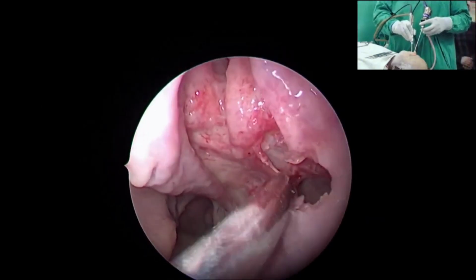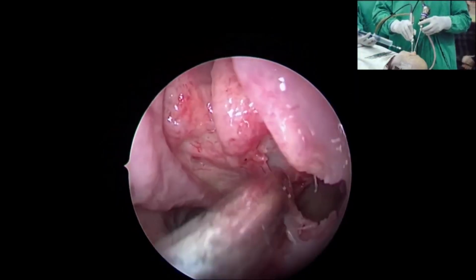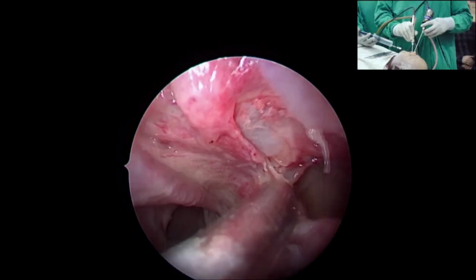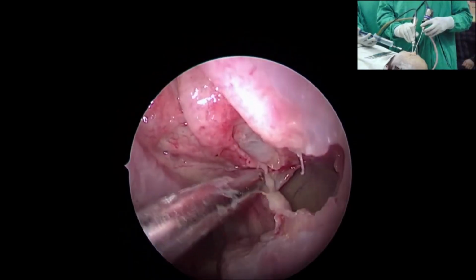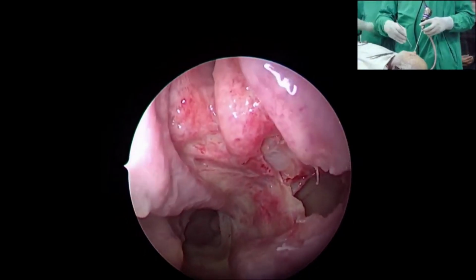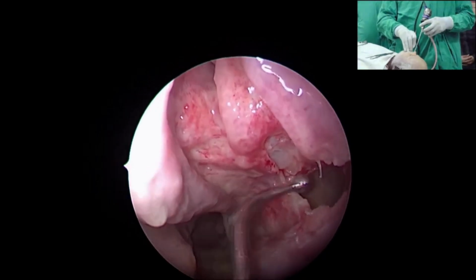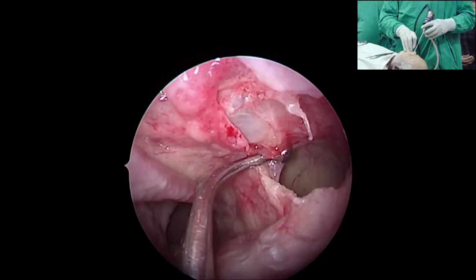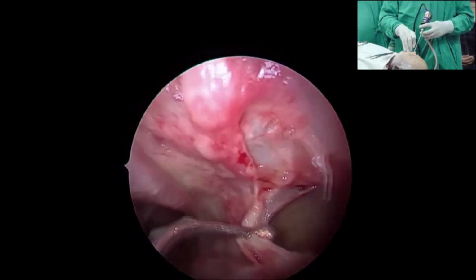And what I can do now, I can debride this redundant mucosa and this portion of the uncinate to open it further. So this is a sort of middle meatal antrostomy. See, the same thing is done by various people by various means. The important thing to carry out is not to peel off the mucosa to bare the area. At the same time, you can evert a little bit of mucosa and communicate any accessory ostium there to the natural ostium. These are the important things to carry out in this middle meatal antrostomy.